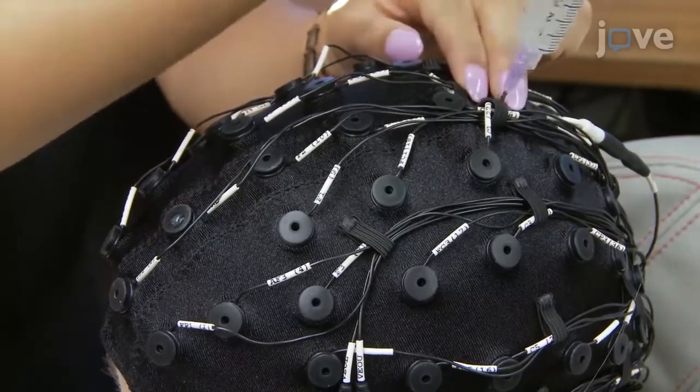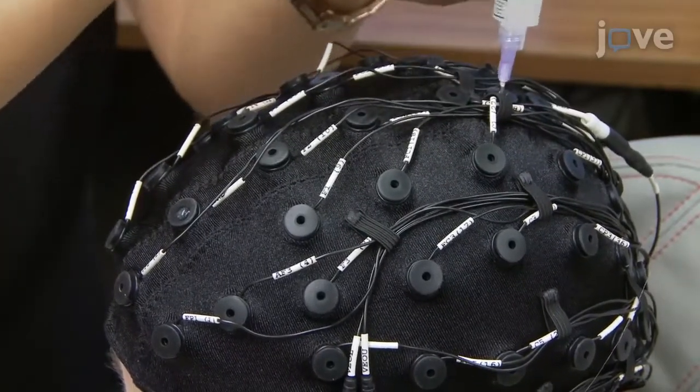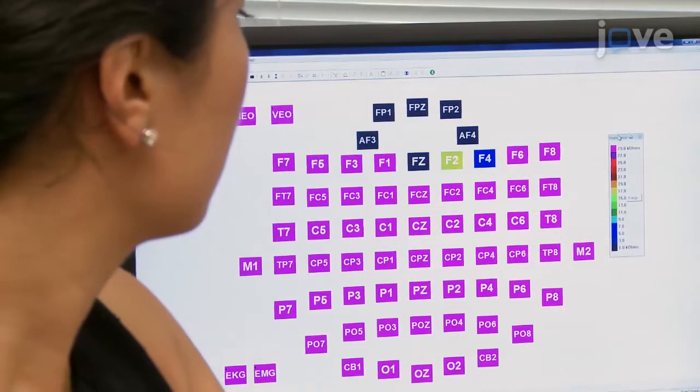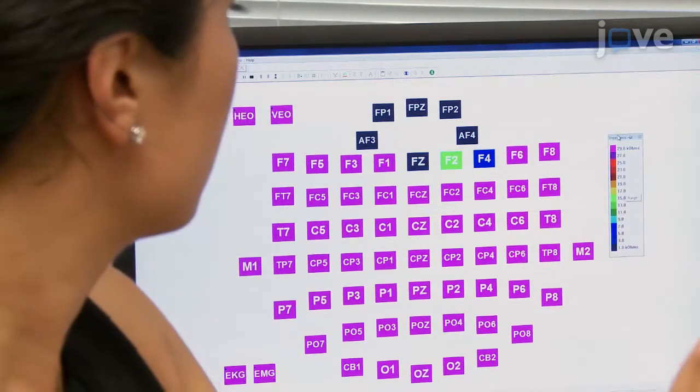Prepare the ground and reference electrodes first. Check that the impedance is under 5 kilo ohms for all electrodes. Electrode preparation determines the quality of the recorded brain signal and minimizes the need of signal processing methods that may remove both noise and brain signal crucial for each study.